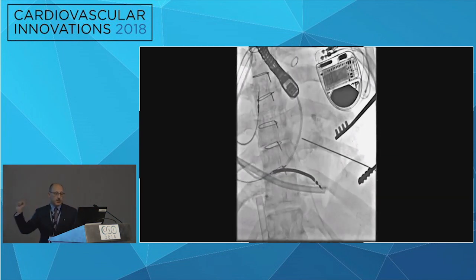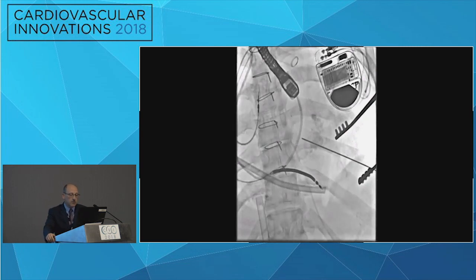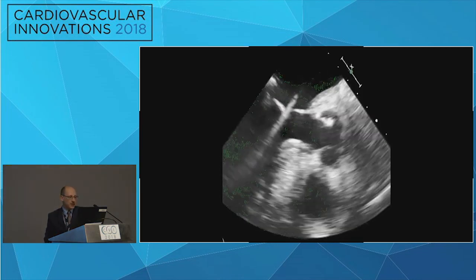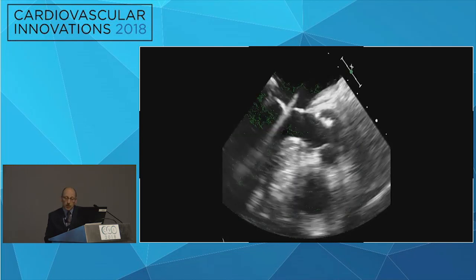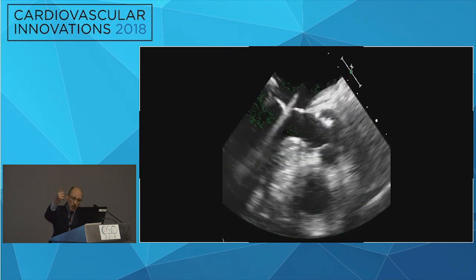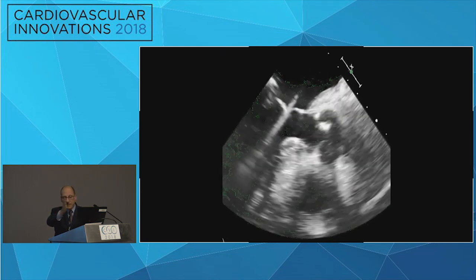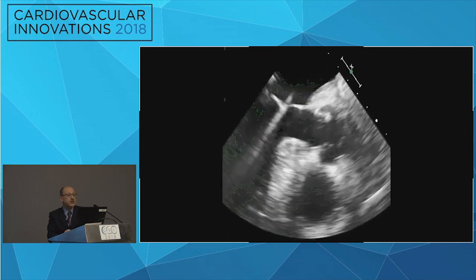This is the pericardiocentesis needle through the transapical approach. This is the surgeon moving the needle into the LV, and this is probably the most challenging portion of the procedure, where the surgeon has to navigate the needle to find the anterior mitral leaflet and penetrate it. A reasonable approach is to actually get into the apex, put a J-tip wire into the left atrium, introduce the needle over that, and then withdraw, and then you'll have a little bit more of a focused field rather than going blindly.